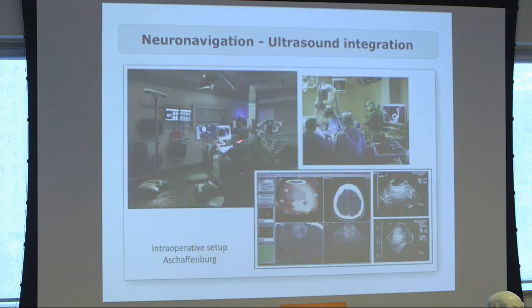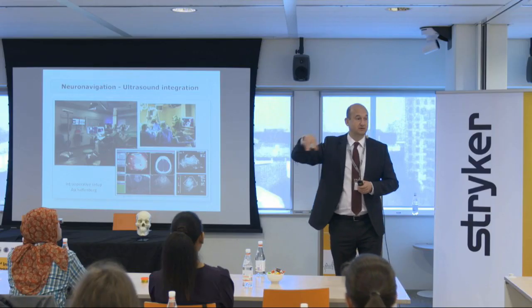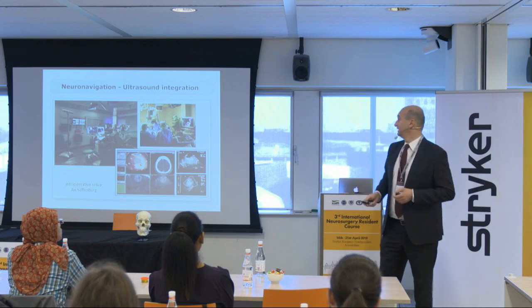This is the setup, my setup in Aschaffenburg. We've got the neuronavigation here, ultrasound here. The head's supposed to be here. And I like to have it so I can see my hand, the probe, and the screen at the same time, because that gives me a better idea of the sector in which I am working.